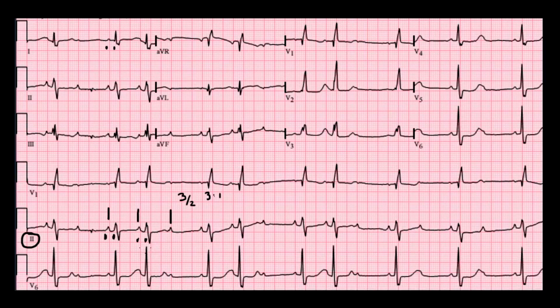Well, you know that the non-Wenckebach or Mobitz type 2 is a block that is below the AV node, okay, even though it's classified as an AV node block. And as a result of that, your QRS complex is typically going to be widened. And certainly we can see here that that QRS complex and that one there, in fact, all of these QRS complexes are a little bit wider than we would expect. So again, here we have 2 things going for us that make us think that this is a second-degree Mobitz type 2 or non-Wenckebach AV node block.